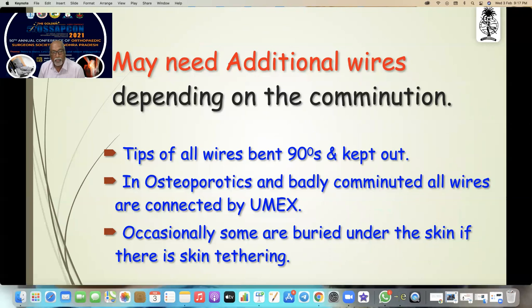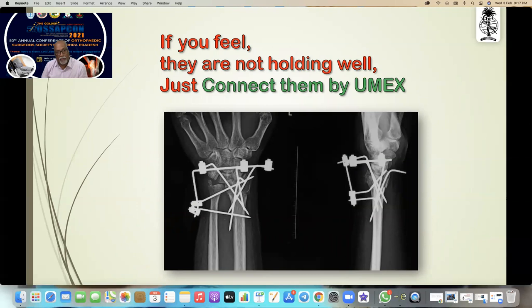Sometimes you may need additional wires depending on the comminution. All wires are bent 90 degrees and kept outside. In osteoporotic and badly comminuted fractures, when you think wires are not holding very well, you can connect them together by UMEX. Occasionally some are buried under the skin if there is skin tethering — if you feel they are not holding well, just connect them together.